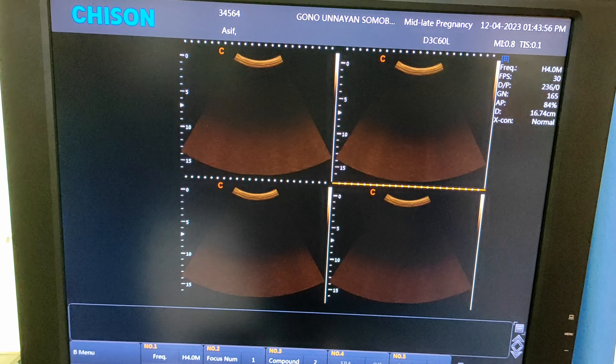This one is the type button, or text button. You can type any type of text on your screen using this button. I type 'liver.' Now press the enter, OK, or set button to set your text. This one is the clear button — press it to remove the text or arrow mark from your screen.